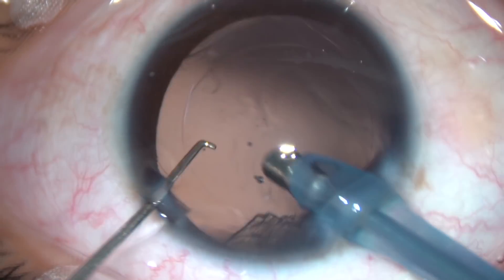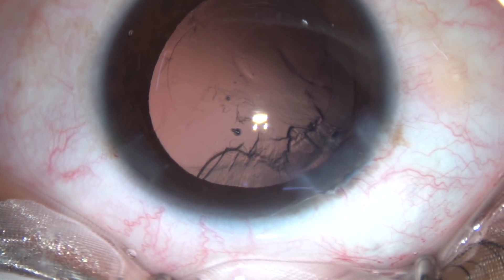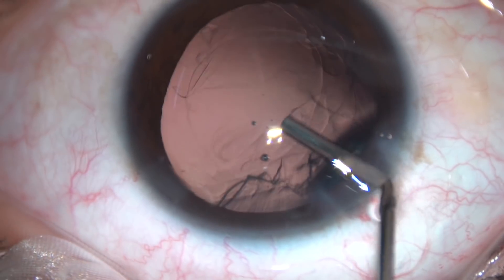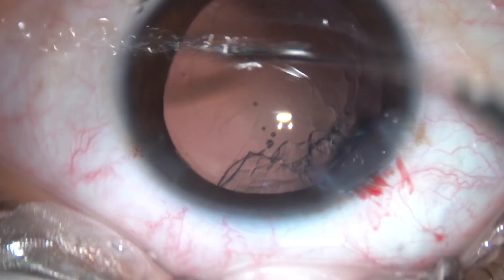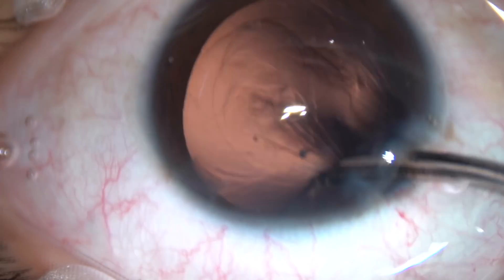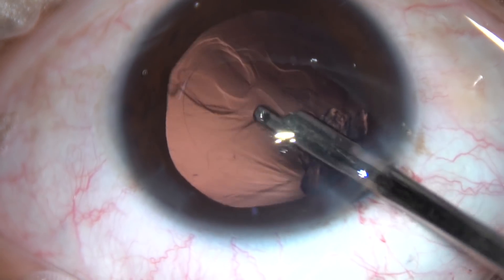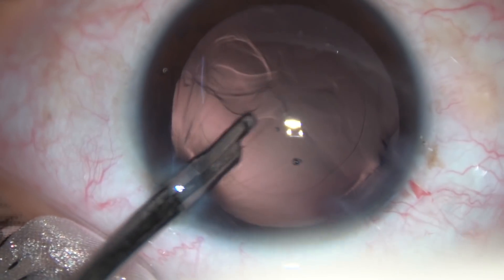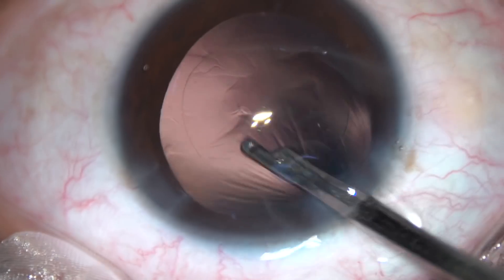Very slowly and very gently, we have removed the lens. Viscoelastic is again injected to keep the anterior chamber formed while we remove the remaining lens matter. The cortical matter is only sub-incisional; in other parts there is no lens matter.